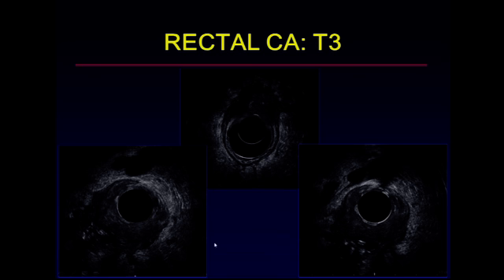So in these two patients, this is one patient down below and a second patient anteriorly, you can clearly see this large tumor disrupting all layers of the rectal wall, clearly extending anteriorly into the echogenic perirectal fat. And here in this very large tumor, you can see several areas here at about 4 o'clock, here from 9 o'clock to 6 o'clock, where you see these lobular extensions of tumor into the perirectal fat and probably some adjacent lymph nodes as well. So again, a T3 tumor.